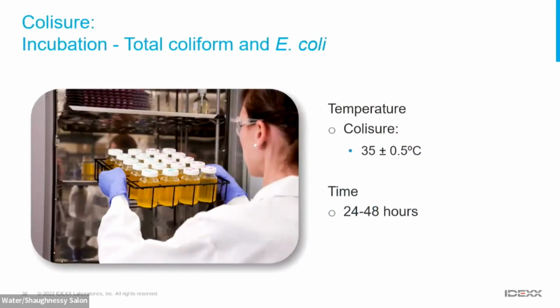Okay. Colisure, again, coliforms and E. coli, we're looking at incubating samples at 35 degrees C. And again, Colisure is a little special in that it's a 24-hour test with results valid up to 48 hours. So it gives you either a day or 2 days in order to be able to read your results.